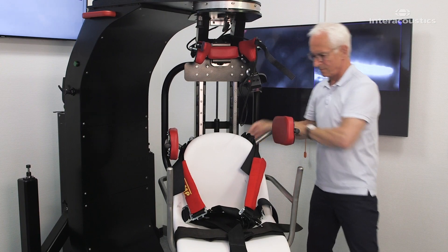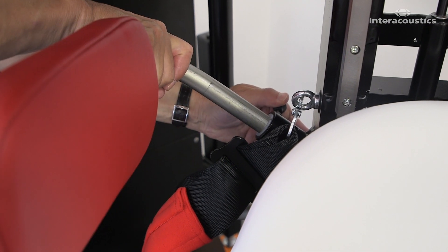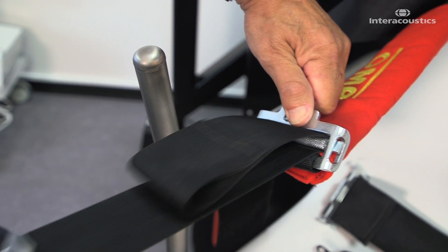Place the arm supports in their widest positions. Expand all the straps and supports, and move them to the sides.